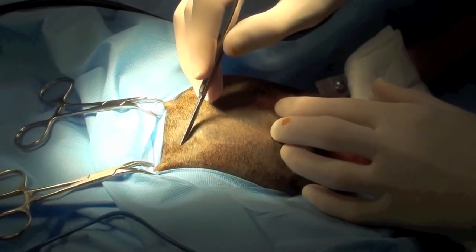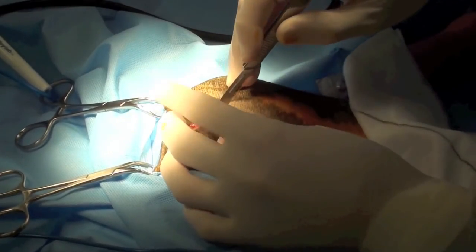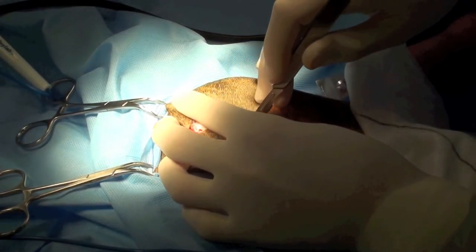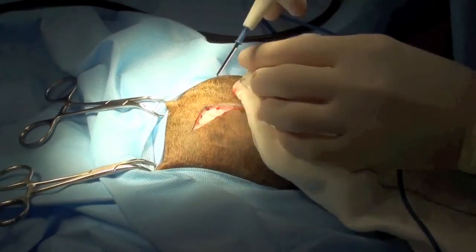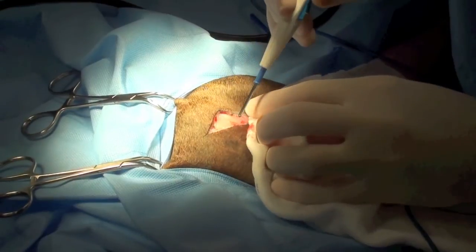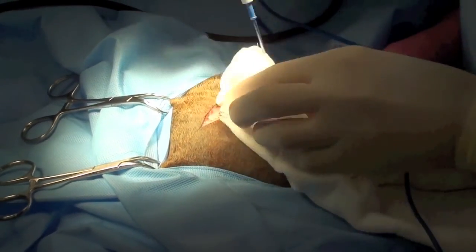A curvilinear incision is made on the lateral aspect of the left coxofemoral joint, extending along the interface between the superficial gluteal muscle and the tensor fasciolata, along the cranial leading edge of the biceps femoris muscle. Electrocautery is used to stop small cutaneous bleeding.